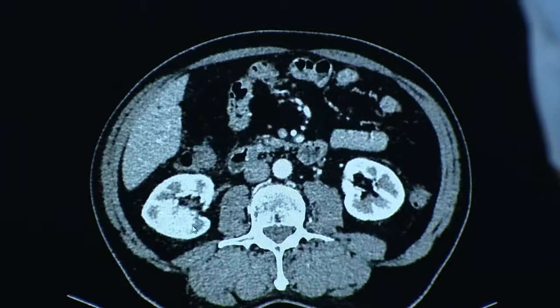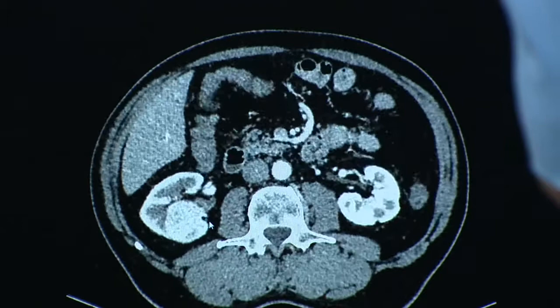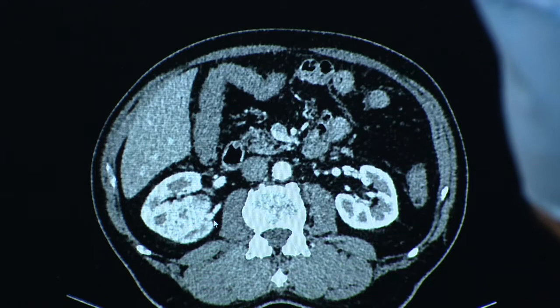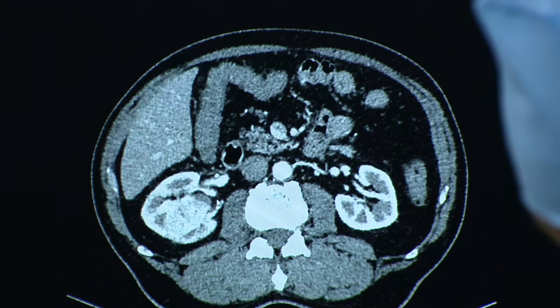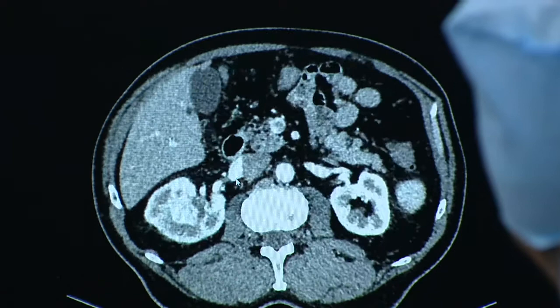Now let's look at the vascularity. Here is an artery going straight into the tumor posteriorly, an arterial branch, the posterior branch. You can see this posterior branch going straight into the tumor, which obviously will need to be taken. So the posterior branch needs to go. Here is an anterior branch. This is the anterior division of the posterior branch, and this is the anterior artery itself.